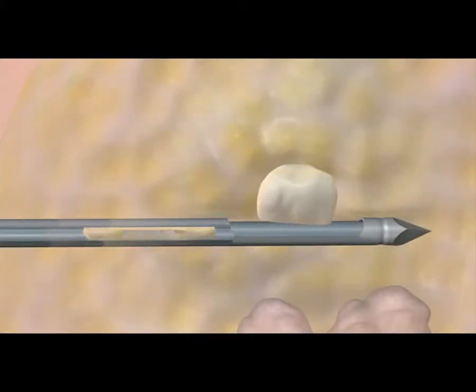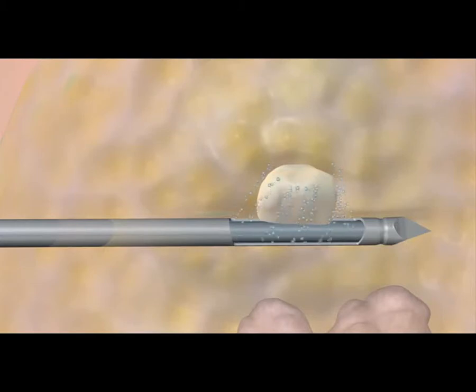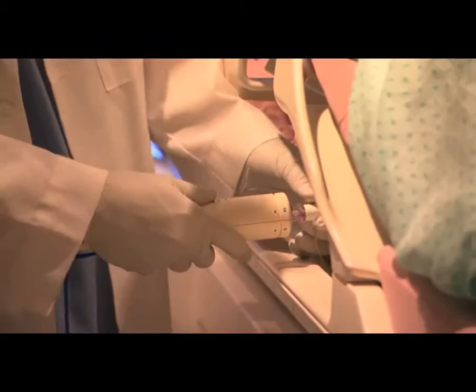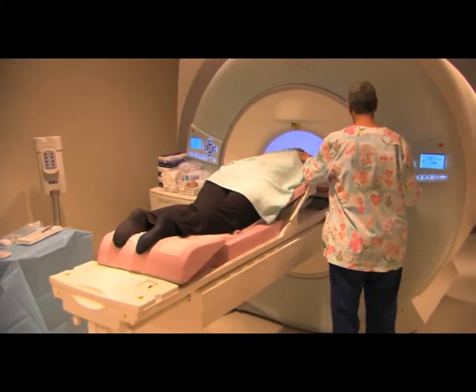Vacuum pressure is used to take out the sample, flushing the area with fluid at the same time. They take a few samples to make sure they have enough tissue for diagnosis. This could take a minute or two. You'll hear a beep as each sample is taken. After they've taken the sample, they will reinsert the obturator and move you back into the magnet for a final set of images, just to confirm that everything worked as it should.